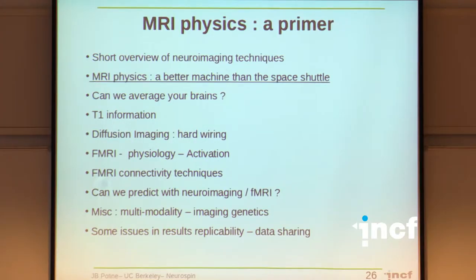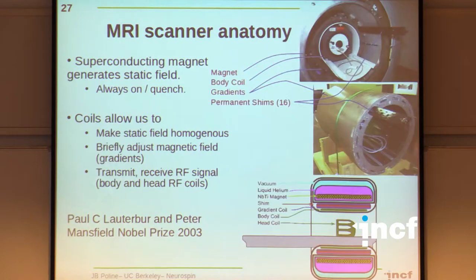All right. So MRI physics. I'm going to give you a little bit of a primer on that. Again, it's going to be very rough, but hopefully you'll get basic ideas, and maybe enough to go back to the web and look at some things if you are interested.